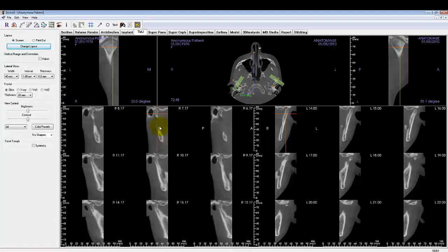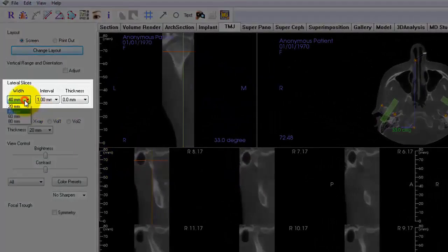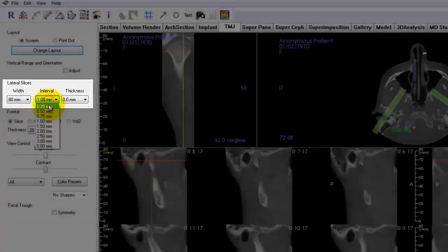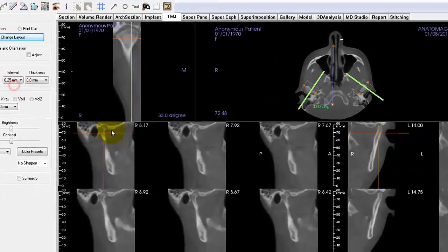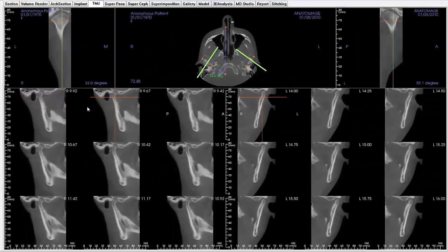Other ways to control slice visualization are through the lateral slice options in the control panel. Slice width changes the captured width of each slice. Interval changes the distance between each slice. And though not shown, thickness averages the slices within the set thickness value to each slice image.